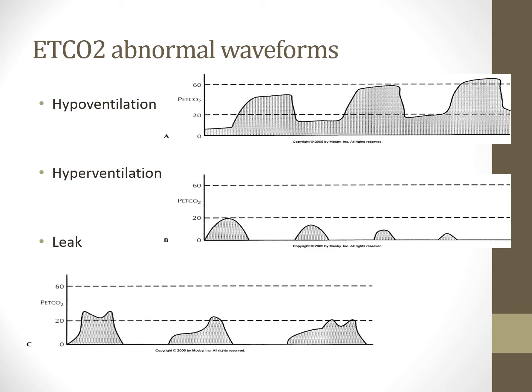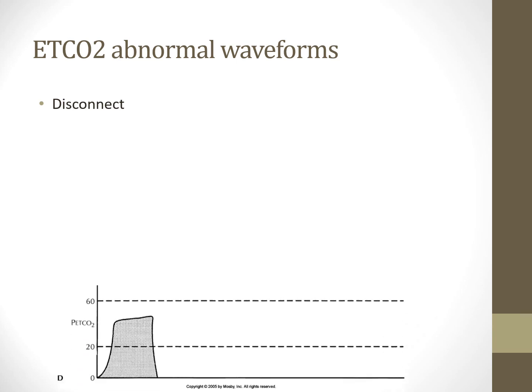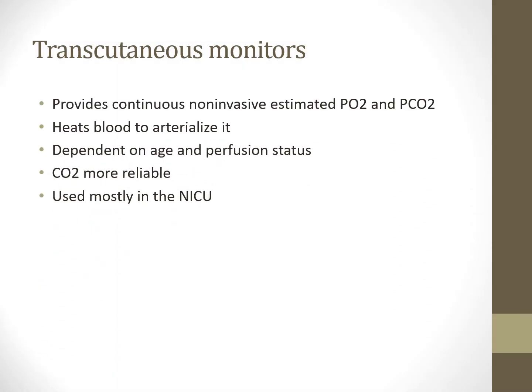So your CO2 level is placed there. Abnormal waveforms: if there's a disconnect, you usually see it go down to almost nothing, so you'll know the patient's extubated. So waveforms, pay close attention to the waveforms. That's a big indicator of what's going on.